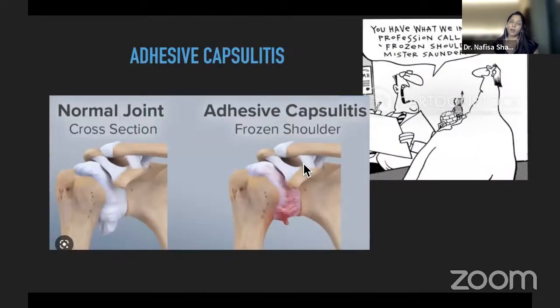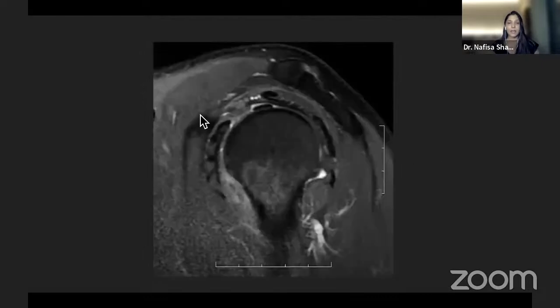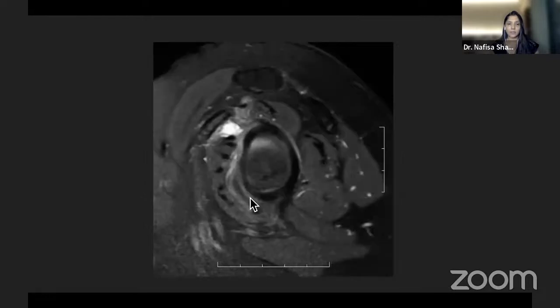Another condition, very common, adhesive capsulitis. Patient comes with pain, restricted range of motion. It's because of inflammation of the capsule as well as the ligaments around the shoulder. On MRI, classically, you'll see inflammation at the anterior band of the IGHL, and another place is the anterior rotator cuff interval. But if the findings are more confluent, you can even see the entire anterior and posterior capsule showing a high signal like a solar eclipse, or it's called the corona sign.